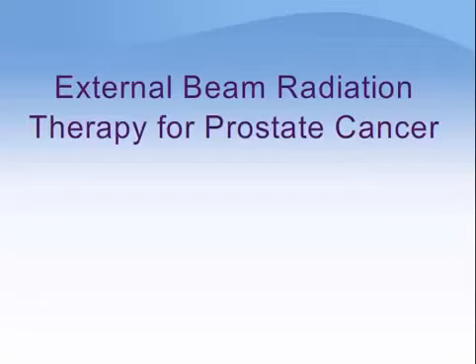Welcome to this educational program. This module discusses external beam radiation therapy for prostate cancer. There are other modules available that provide an overview of prostate cancer and discuss other treatments in greater detail.